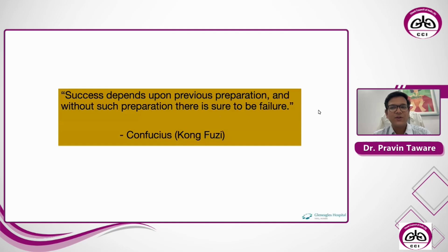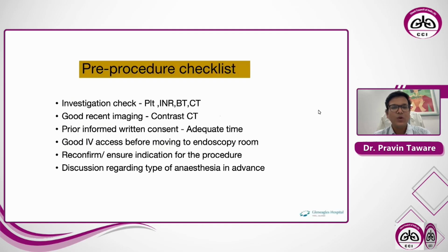One of the Chinese philosophers, Confucius, quoted, success depends upon previous preparation, and without such preparation, there is sure to be failure. So before every procedure, you need to prepare things and keep them ready. Before every procedure, you should have a checklist like that.